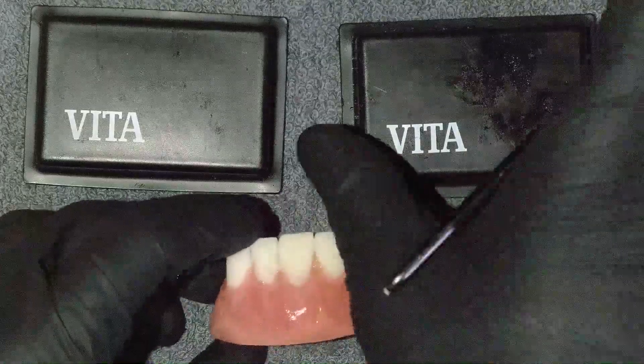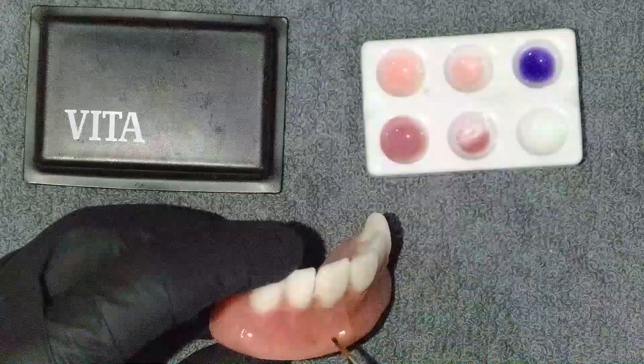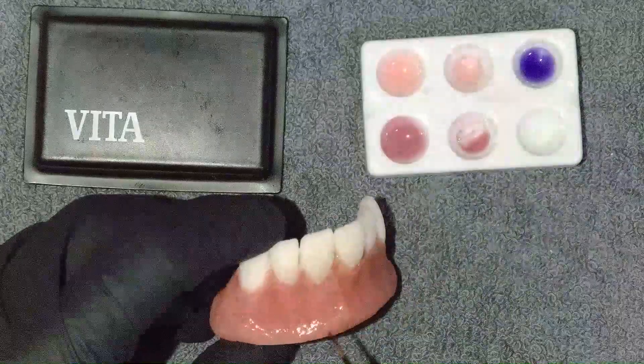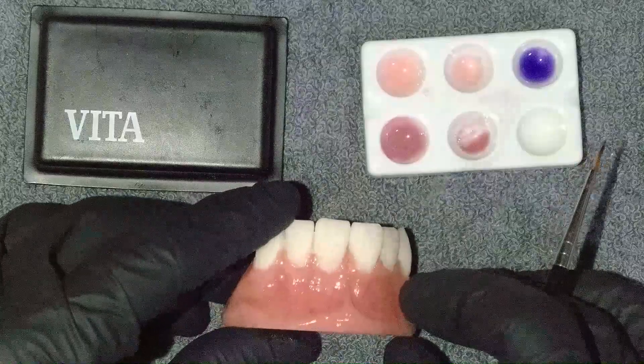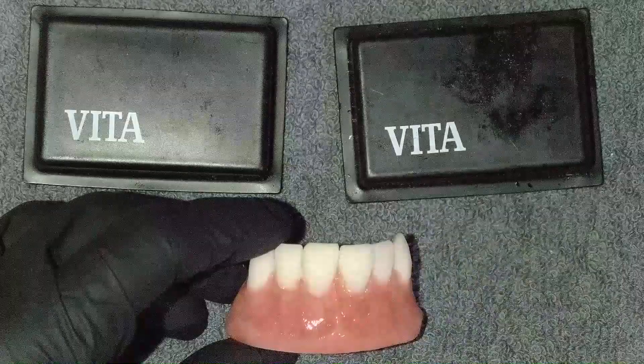Now that I've cured that one, I'm going to add a little bit of purple down at the bottom, like I did on the other one. There we go — I like that effect, it's really nice. Let me cure it real quick.